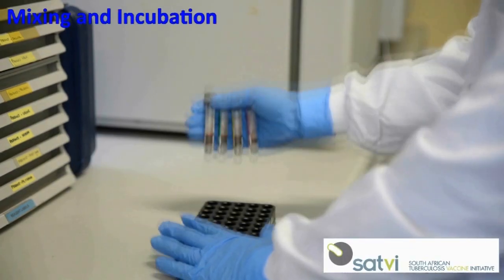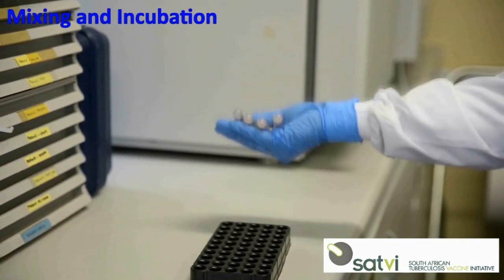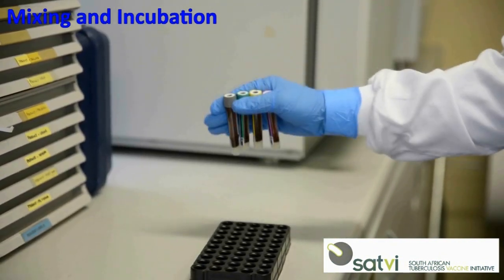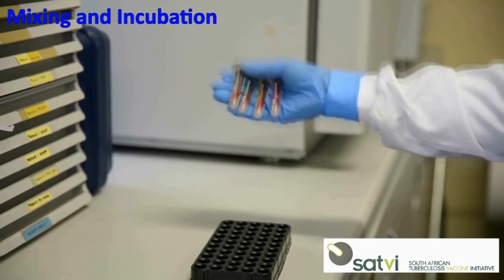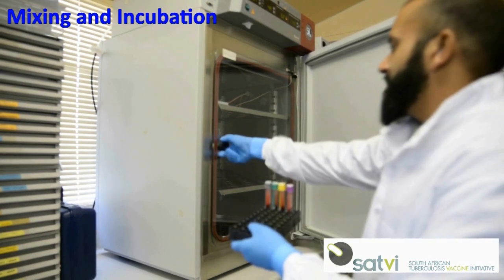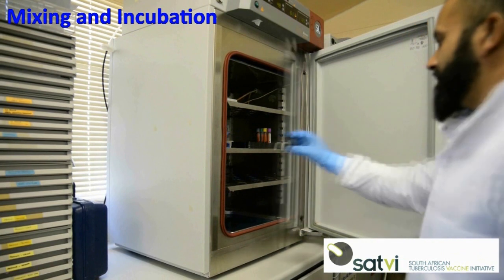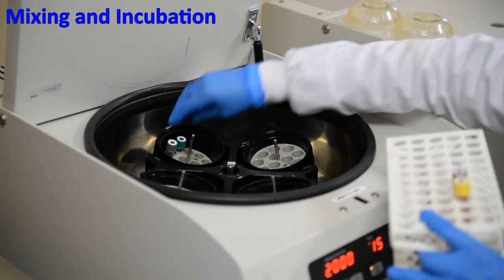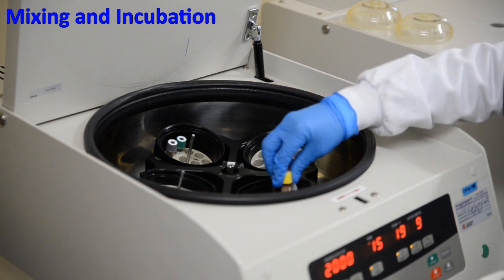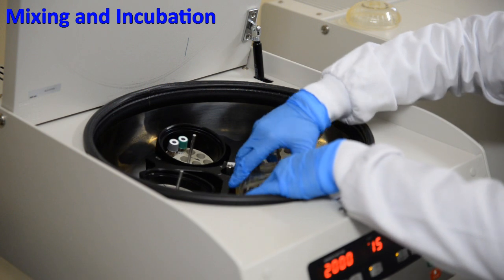After blood collection, invert the tubes 10 times, firmly enough to ensure the entire surface of the tube is coated with blood to dissolve the antigens in the tube walls. Incubate the tubes at 37 degrees for 16 to 20 hours. After incubation, centrifuge the tubes at 2000 to 3000 RCF for 15 minutes.